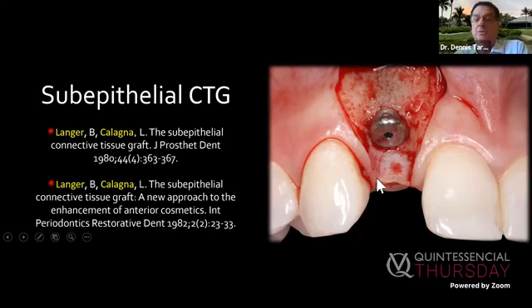I opened it up. Now, what do I do here? I do papilla sparing incision. Now, this should be a major part of our discussion. I know Uli and I have discussed this numerous times, and Ernst, you in some cases did this, in other cases you open the papilla.